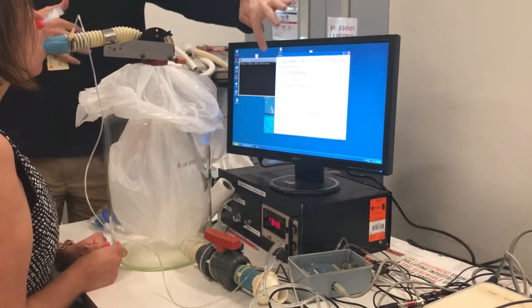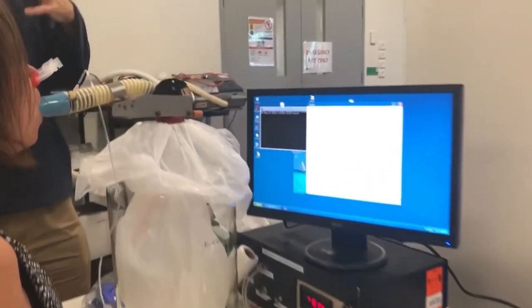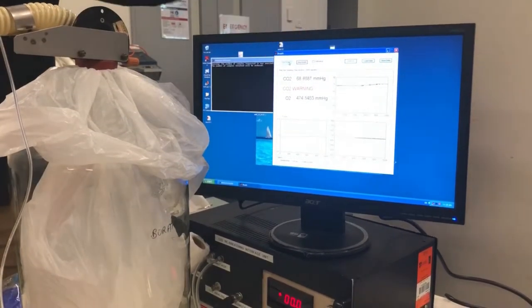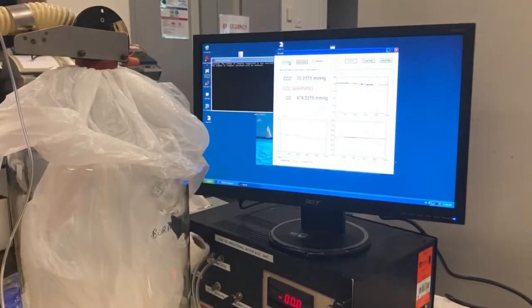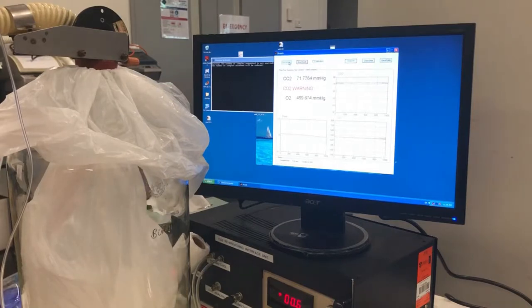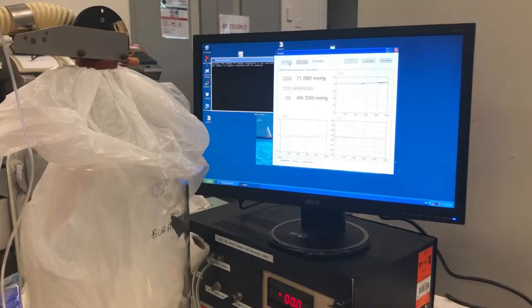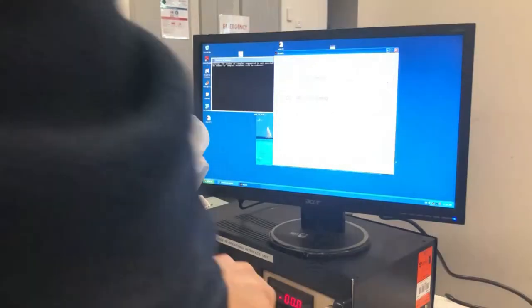During the demonstration I always remind the student how much oxygen they have. They're going to start feeling short of breath and it may feel a bit funny breathing a different mixture. I remind them that room air is 160 mmHg oxygen but they're currently breathing 460 mmHg, so there's three to four times the oxygen that everyone else in the room is getting. Anything they're feeling is due to the CO2, not loss of oxygen — that reassures the student. The CO2 levels have gone up 10 mmHg; we usually try to finish around 75 mmHg, so I'm going to do the second restriction now.